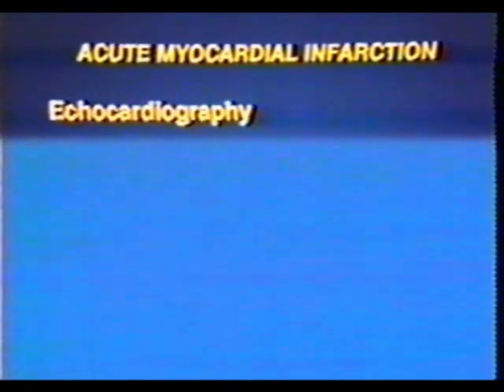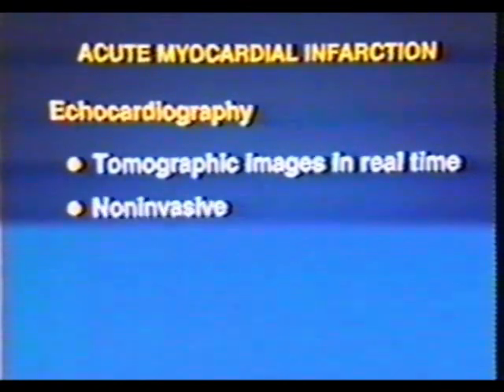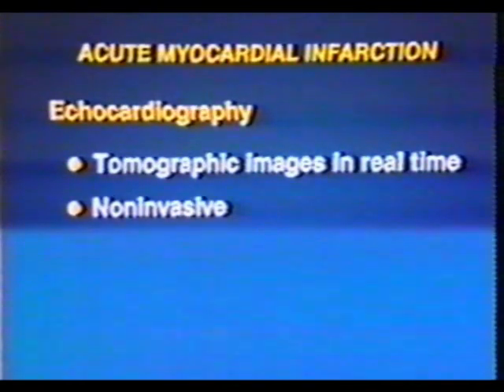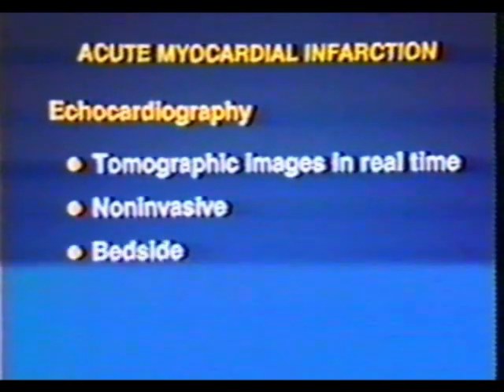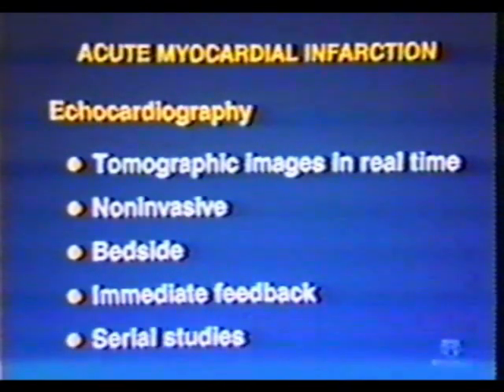It provides tomographic images of the ventricles in real time and this important information is obtained non-invasively. The studies can be easily performed at the bedside, and the cardiologist is provided with immediate feedback about the structure and function of the heart. Furthermore, echocardiographic studies can be repeated in serial fashion as often as the clinical situation dictates.